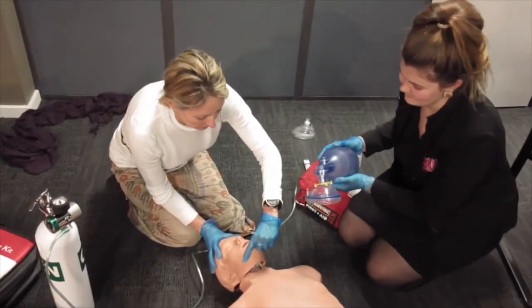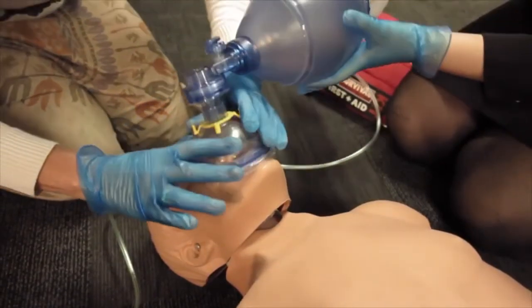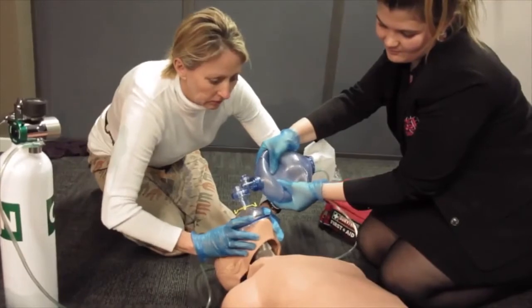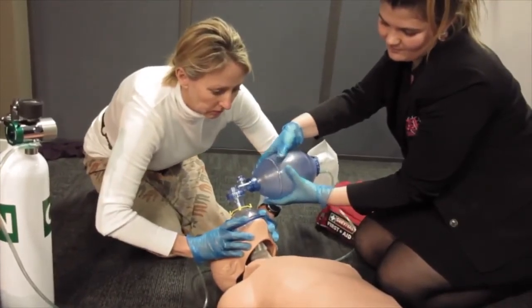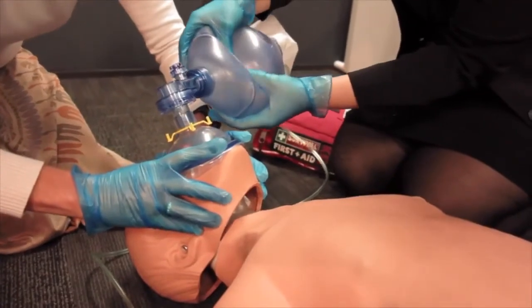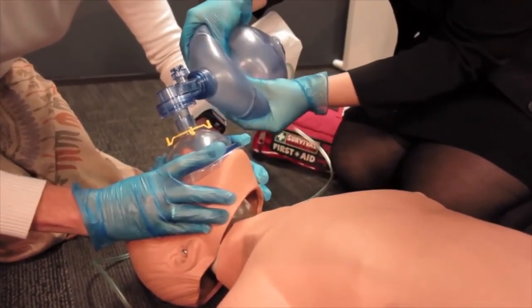Ventilation using a bag valve mask requires more than one first aider. One first aider should be positioned at the top of the patient's head, use the head tilt and jaw thrust to open the airway, and make sure to create a proper seal on the mask. The second first aider can then ventilate the patient with the bag. Make sure to evaluate the chest.